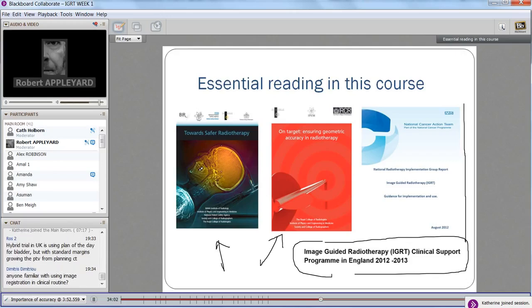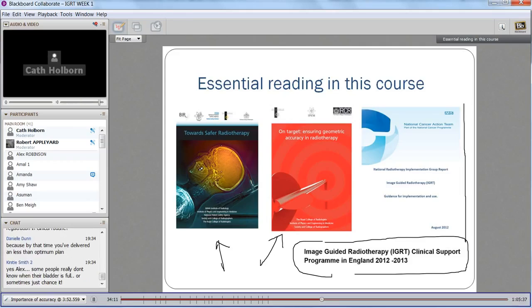Thanks, Kath. Yeah, that's exactly right. Sorry, just to say one more thing. Like you said, the ultimate form of adaptive radiotherapy, moving beyond the plan of the day, is to not create lots of plans at the pre-treatment stage, trying to predict what the variation might be for that patient, but to just go with one plan, and then adapt the plan on a daily basis based on the size, the shape, the position of the target, and do this daily online replan.